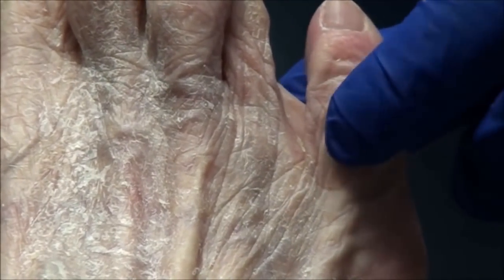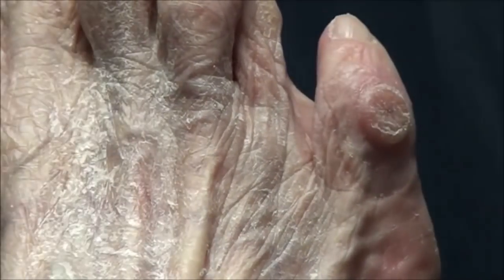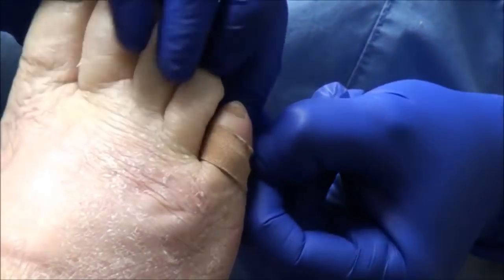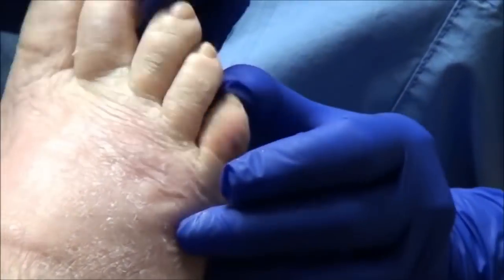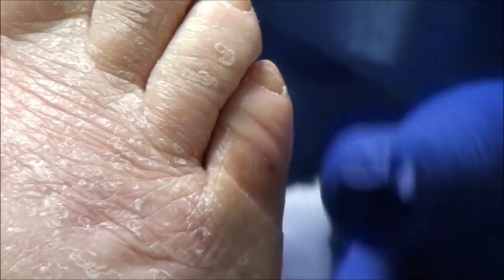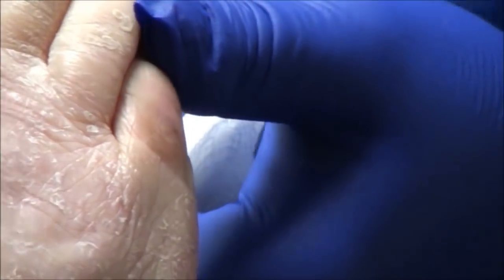Right here I'm just pressing so that she can see if it feels better or if I need to do a little bit more. Last week when you were here we trimmed this callus down — there was an open sore underneath the little corn, and it was really painful, much more so than usual. So how has it been since we trimmed it?